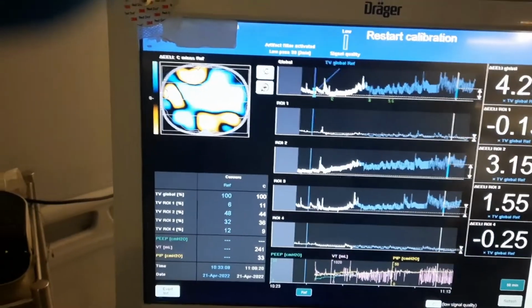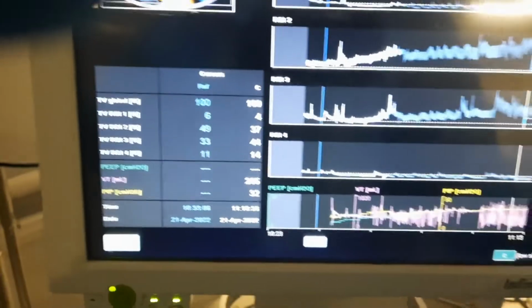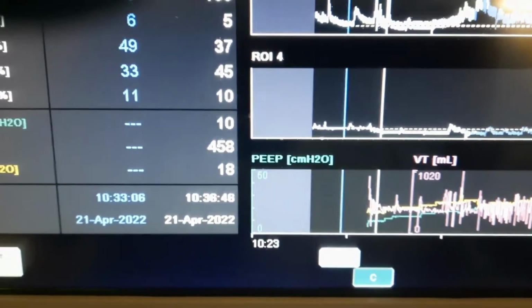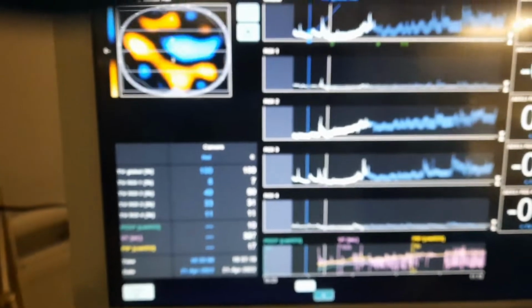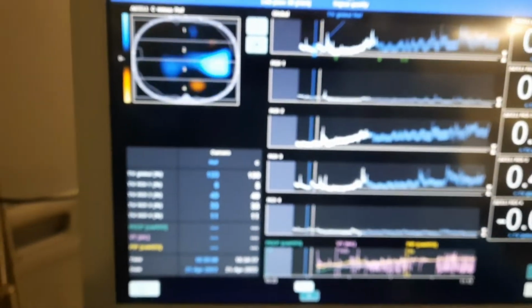And here is the patient when they're on OptiFlow over here. And then after, you see over here in green, this is the incremental PEEP trial that wasn't really successful in opening anything up. If you look from here, starting with the reference at the same place as what we're checking, we start scrolling.